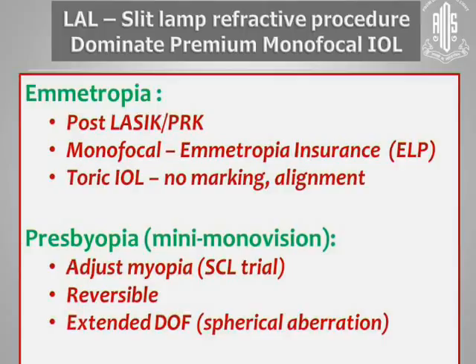You're going to be able to play with the other eye with a contact lens, demonstrate what it's like to be -1 versus -1.5 in the second eye. Maybe they don't like it, and you're going to be able to treat all of the astigmatism like that, and then do an extended depth of focus using spherical aberration like many of the companies are.